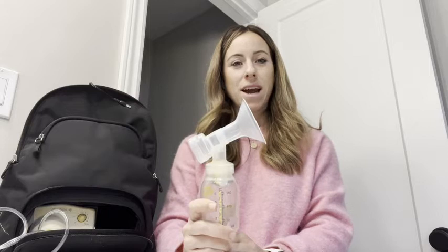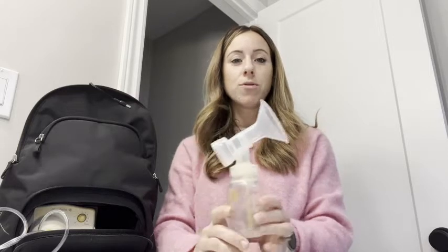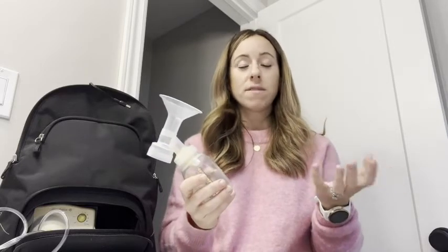Hey guys, Jenna here from WTI. Today I wanted to share with you a piece of the Medela breast pump. I already reviewed the actual breast pump, but I wanted to share some of the accessories. Medela is obviously a very well-known brand — many moms go towards that brand because it works so well.